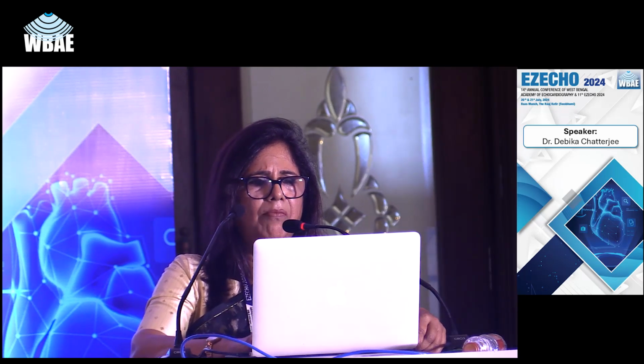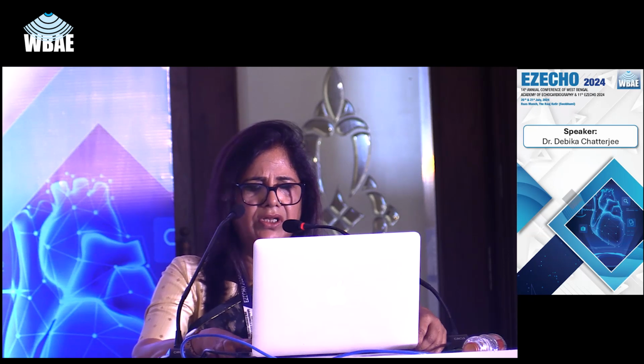A lot of information on right heart hemodynamics can be obtained by echocardiography, like systolic PA pressure from the TR jet, RA pressure from the IVC, and also utilizing the PR jet, we can get diastolic PA pressure by measuring the diastolic PR gradient and adding RA pressure; the peak PR gradient plus the RA pressure gives the mean pulmonary arterial pressure. And also from the acceleration time, we can measure mean pulmonary arterial pressure.